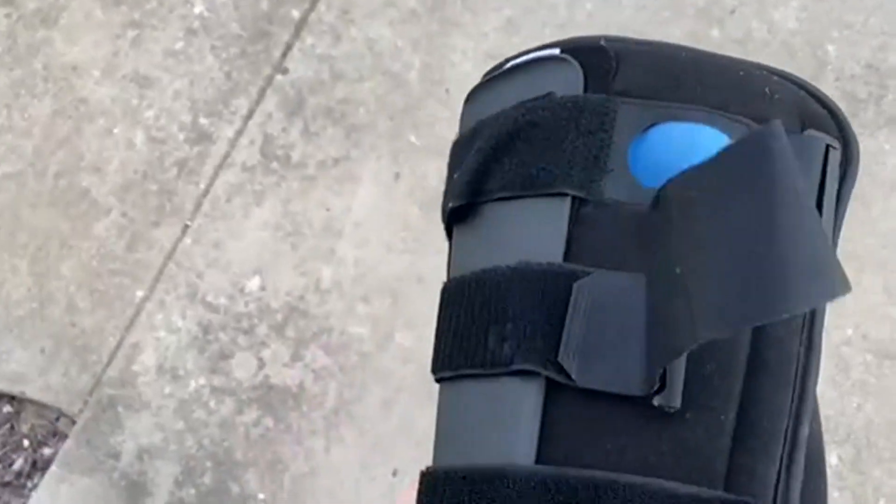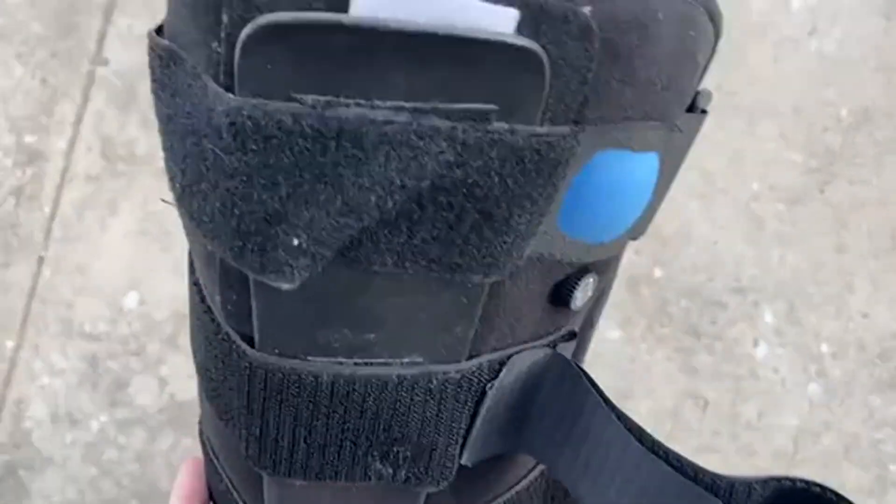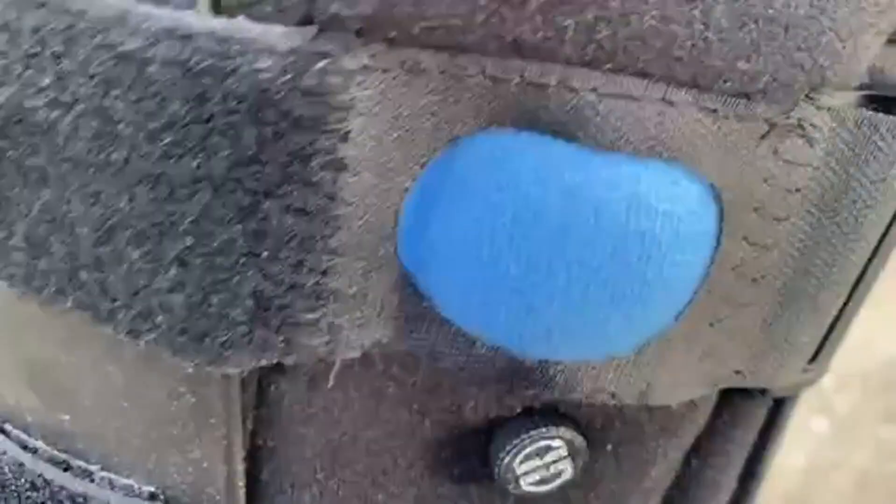Today we're going to be talking about the AirCam Walker. This is for fractures on the ankle or foot. It's a stabilizer boot and it works well. I love the tread on the bottom of this — super rugged, super well made.